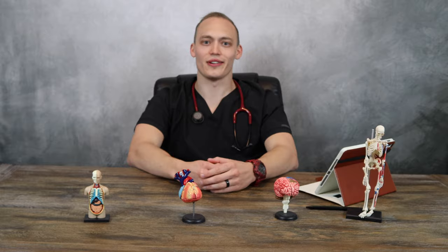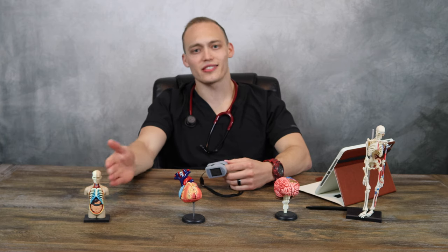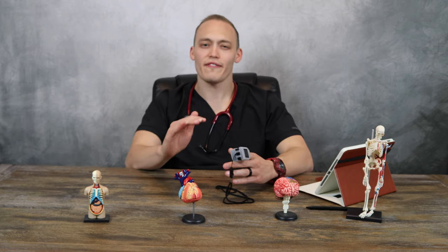When I take a set of vitals, I like to start with oxygen saturation. Pulse oximetry is the least invasive, easiest way to measure the oxygen levels in the arterial blood and how well the tissues away from the heart are perfusing. A normal O2 range in an adult is anywhere from 94 to 100. Little disclaimer here — go with what you are taught because there are varying sources. Some say 94, some say 95, and some say 96. Another cool thing about these pulse oximeters is that they also give you a heart rate.